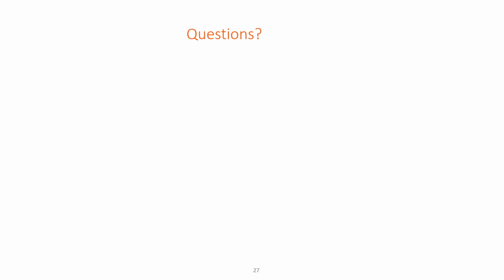I know there's a lot of other people working on standards also. This is a new test, so I think we have to have a little patience. When we started having the head impulse test, we didn't have the normative data yet, and we have it now. I think it's the same with VVOR and VORS, also for explanation of exactly what's going on when we are testing. I know there's a lot of research going on in that area as well, which is exciting. That's what's cool about that tool too.